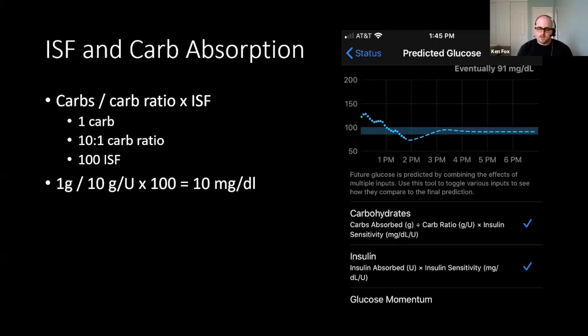Another cool thing about automatic bolus is that you don't have that problem, right? One of the risks of increasing your maximum basal rate normally is that you could have that temp basal rate stuck running if you disconnect, and it might be too much and Loop can't turn it off. But with automatic bolus, you get your bolus up front, 40%, and then if you disconnect from Loop, you don't end up getting more insulin.